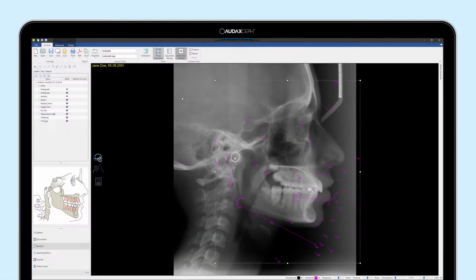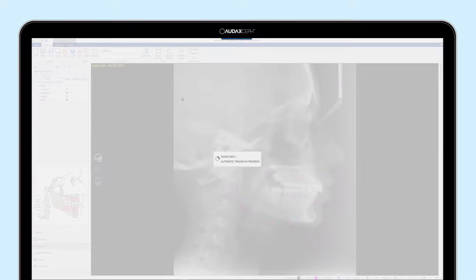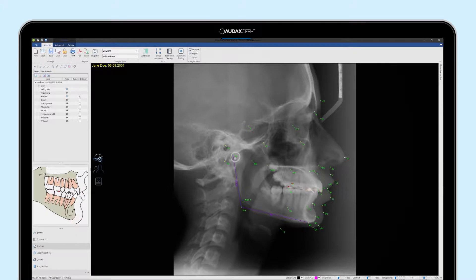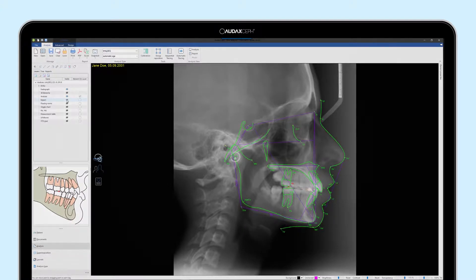AuduxCef is a major time saver. Artificial intelligence will scan your x-ray and find both hard and soft tissue landmarks automatically. Reports are created instantly, so there is no more clicking and manual tracing needed. It is all done automatically by AuduxCef.